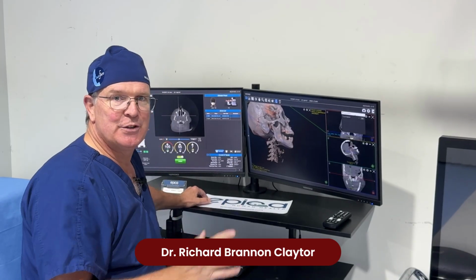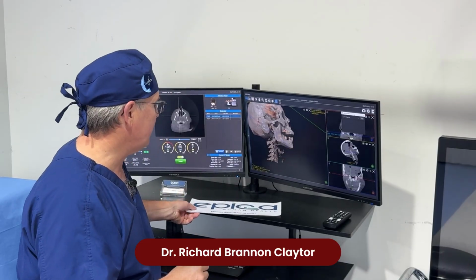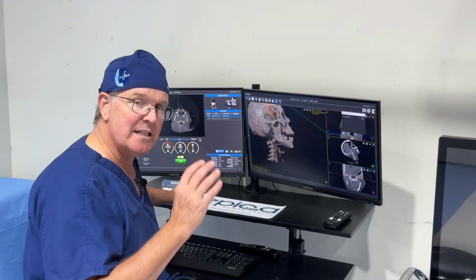Dr. Claytor here. Thanks so much for coming to the MARC Institute to learn about some of the great technology they have, specifically using the M.A.R.C CT scan system.